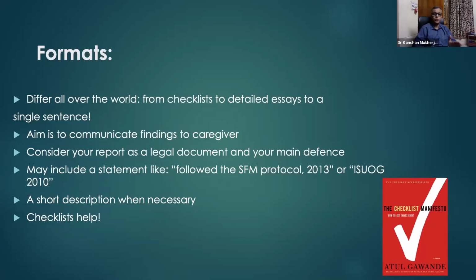Your aim is to communicate findings to the caregiver. So you should actually first find out which format you want to use. And consider your report as a legal document, and it is your main defense in case a complaint arises.